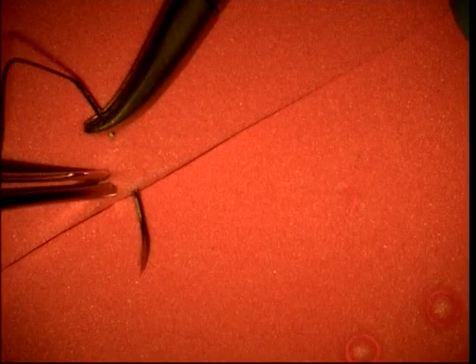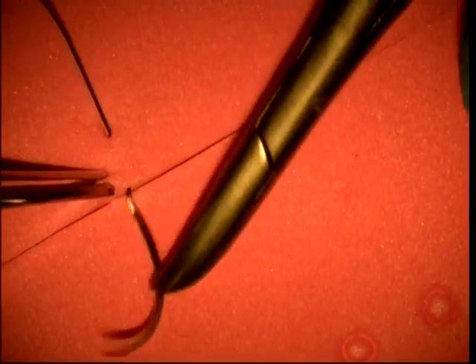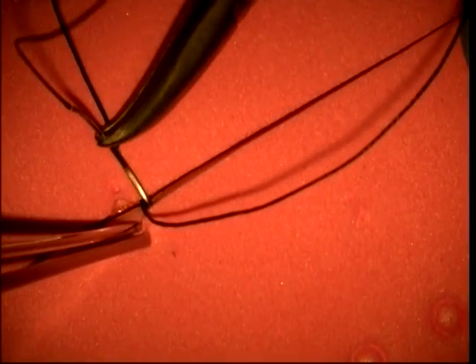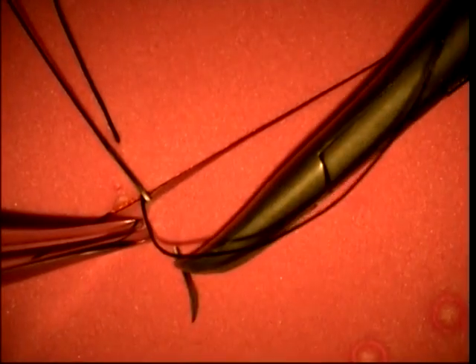Without letting go of the forceps, now grasp the needle again and pull it through the first half of the wound. Now repeat the process again for the other side of the wound, starting from inside and going outside. It will feel a bit strange at first. Try not to use your hands to pick up the suture, but always use the instruments.